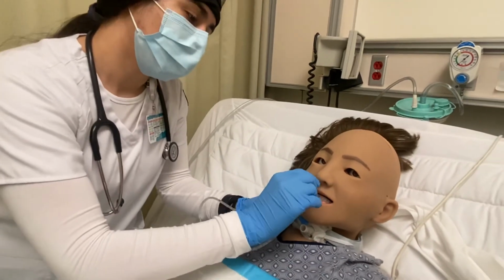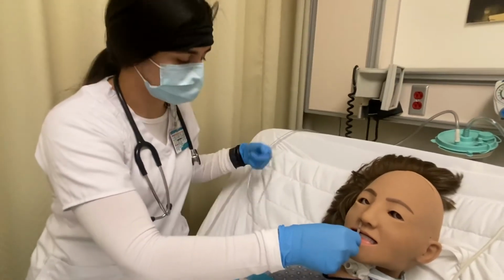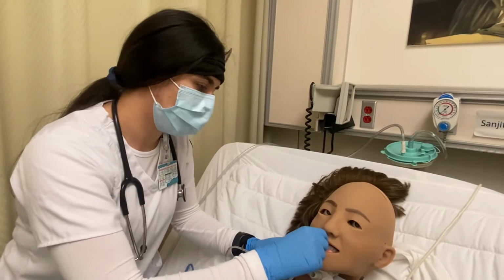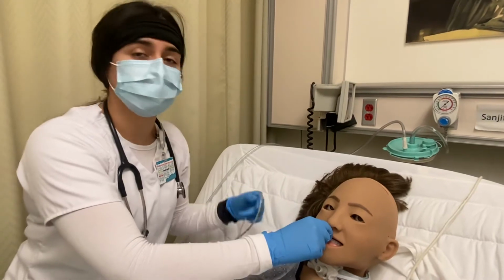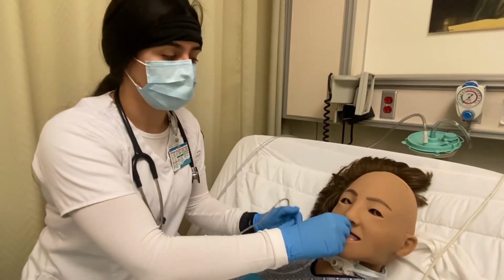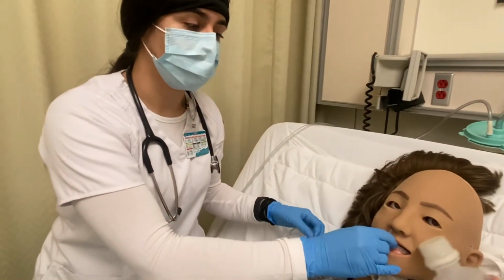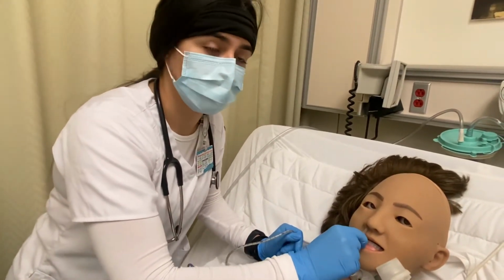So put it down. Once the patient feels it coming down, I would tell them to put their hand up. Then I would give them the water, or have my assistant give them the water, and tell them to swallow every couple of minutes. Every time they swallow, that's when I advance the tube further down.